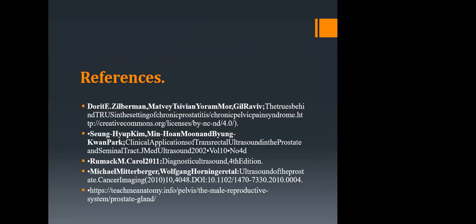My take home is, let's change to the transrectal approach for screening, for detecting, for monitoring, and for discerning how much of the prostate is affected, or what pathologies we are dealing with.